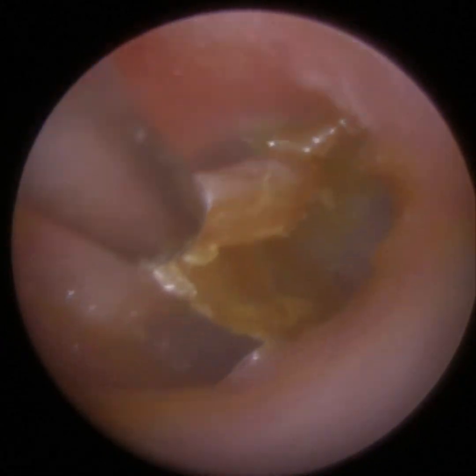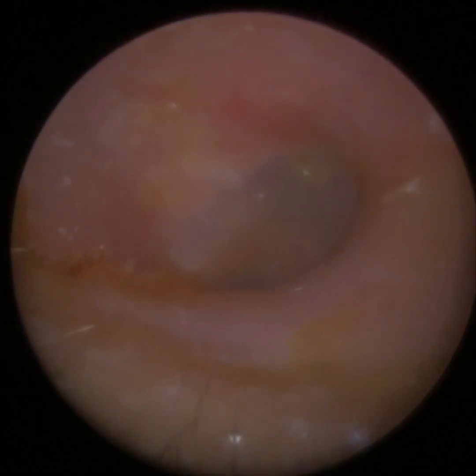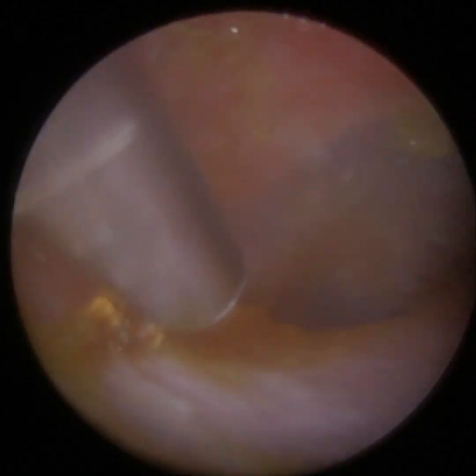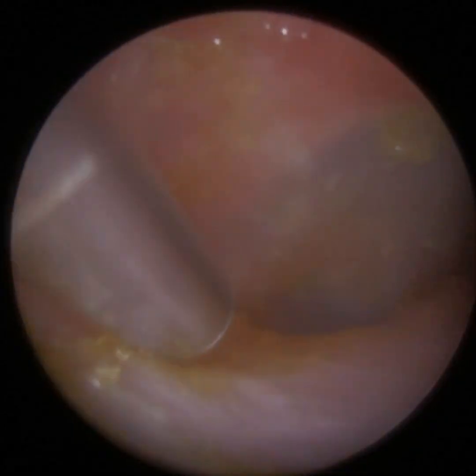And it also creates an inferior recess where I'm just here, and that's at the base of the eardrum. Inferior means the bottom. In some people, these recesses can be really prominent, like a hidden trench, a hidden cave, and you can just about visualise it. But we managed to get it out.